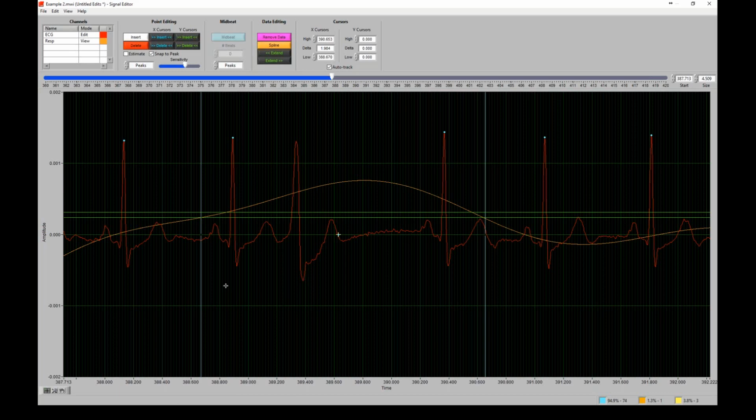If you're seeing P waves in other situations and you're not seeing it for this particular complex, P wave being that positive inflection before the QRS complex. A widened QRS complex, so a longer interval between Q and S will be indicative of these abnormal beats. And then oftentimes you'll also see a shortened QRS complex with a higher amplitude T wave, which I also have an example of that I can show in a moment.